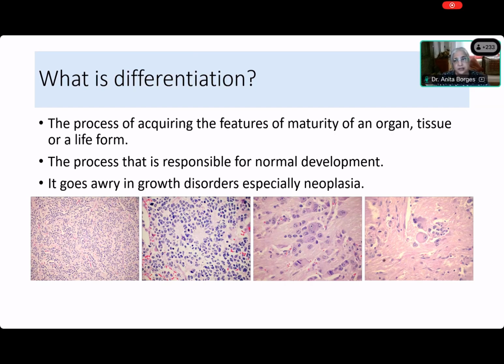Why do you say they're glands, Lalit? How does one recognize a gland? I see some people answering in the chat box. After they've answered, I'll tell you, Lalit, what they're saying. See, you told me very correctly, Lalit, that we've got a small blue cell tumor on the left hand side. Yes. All right. Now, what do we have in the next picture?